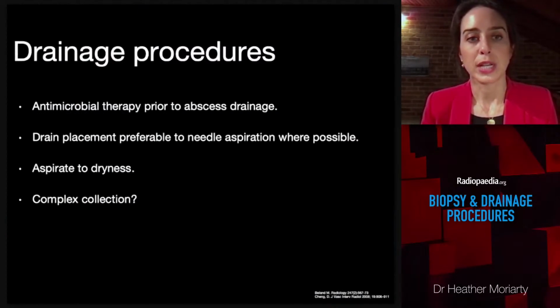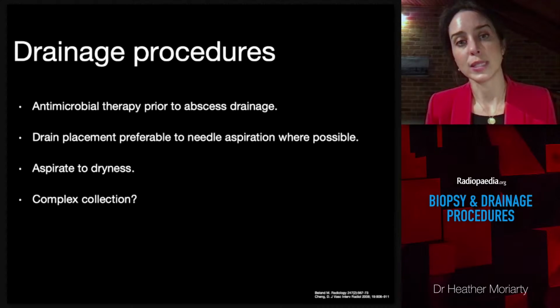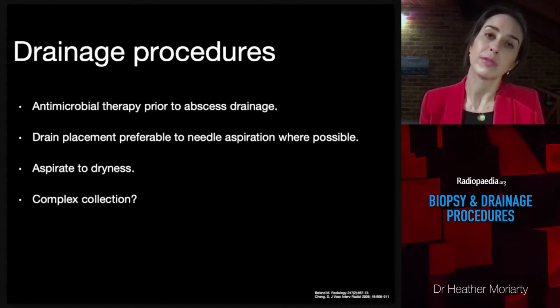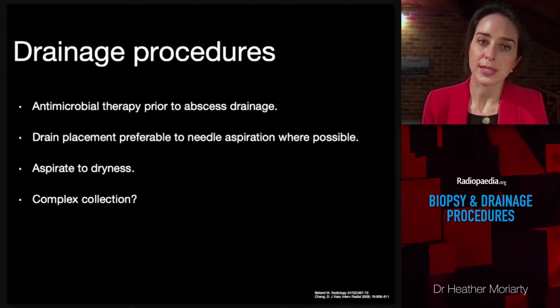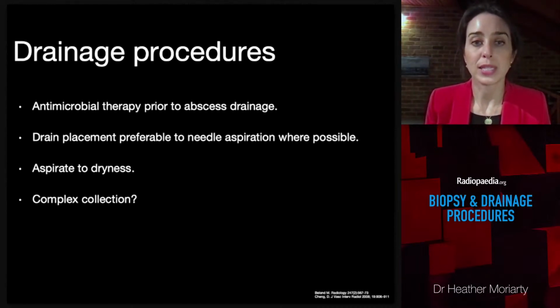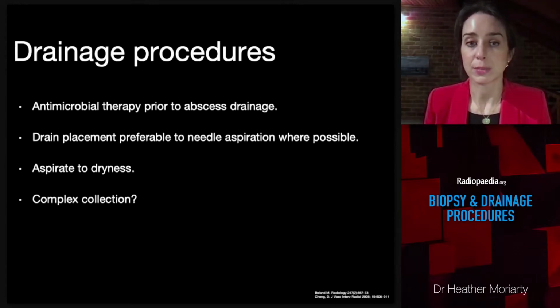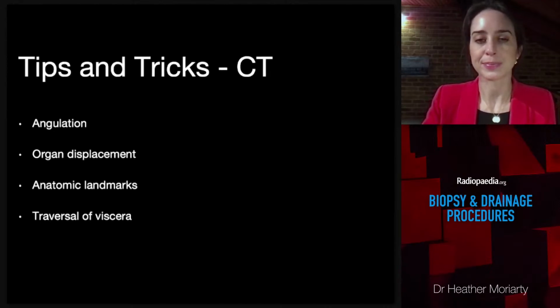So, a few points for drainages. For abscesses, I generally prefer leaving a drain in rather than aspirating alone without leaving a catheter. After I place a drain, I always send a sample and aspirate the rest of the collection to dryness into the drainage bag. There's low volume data on the use of fibrinolytics for loculated collections, but in the small volume of data that we do have, they do seem to improve short-term outcomes in loculated abdominal collections. The actual impact on morbidity or outcomes in pleural drains and abdominal drains is limited, and most guidelines don't routinely recommend it, but that doesn't mean it shouldn't be considered on a case-by-case basis.